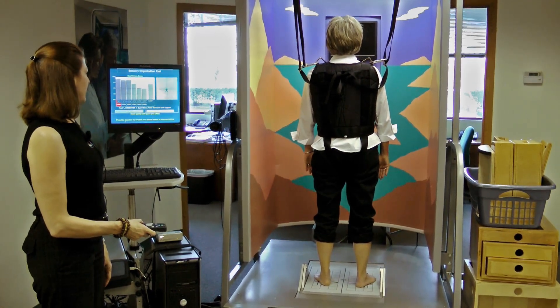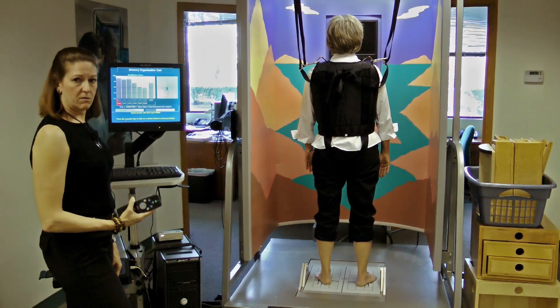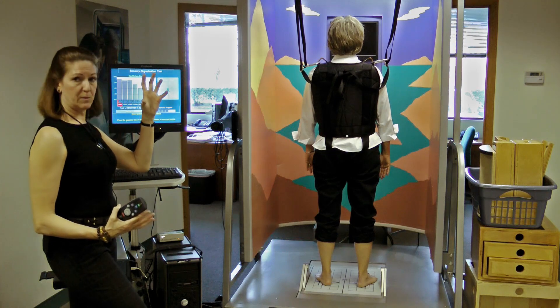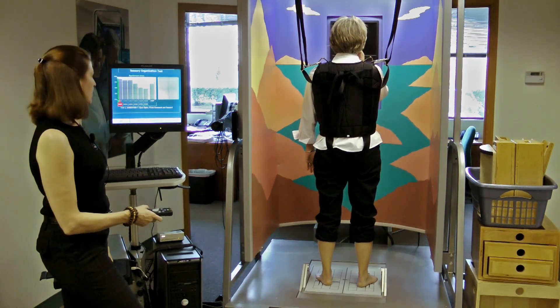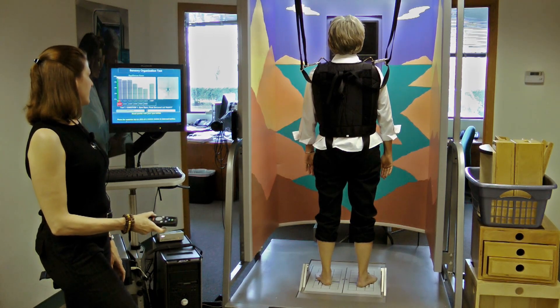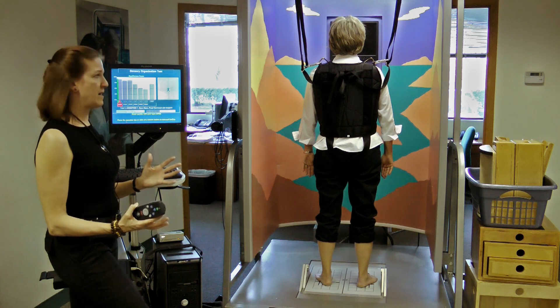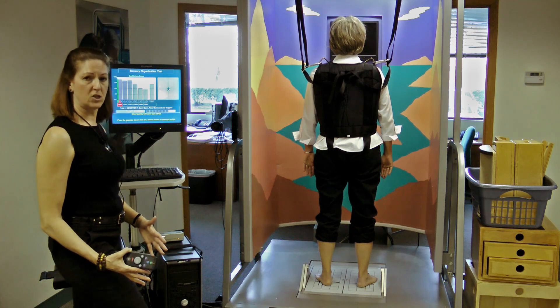Eyes open and testing — stand really steady for 20 seconds. On this condition, she's standing quietly with her eyes open, so she's got all three sensory systems available for balance. She's got vision available, somatosensory information from her feet, and stable information from her inner ear. We anticipate that somebody standing in this type of sensory condition, where all their systems are available for balance, would automatically default to using somatosensory information in the feet and ankles.